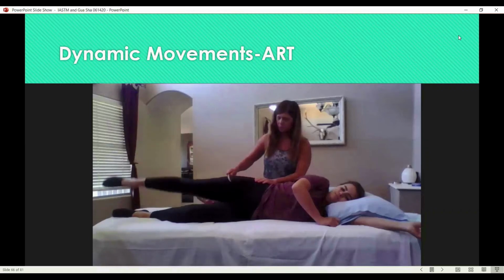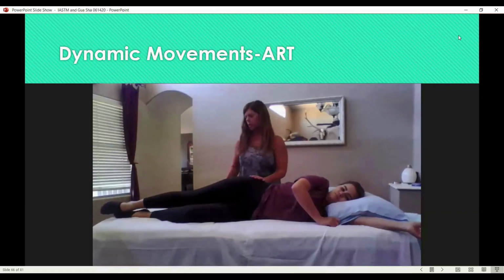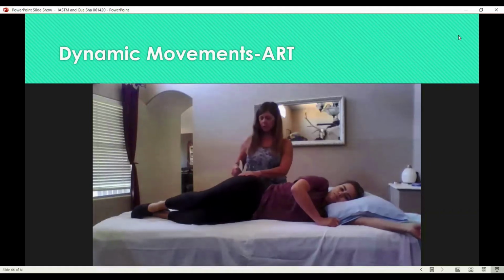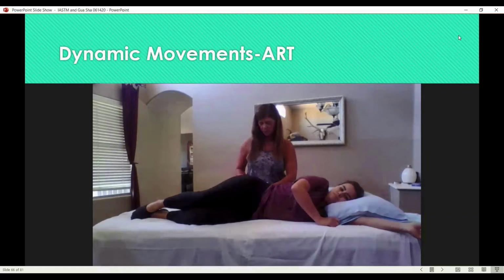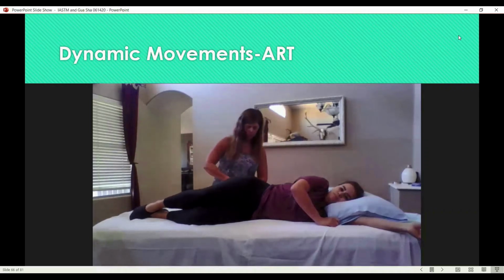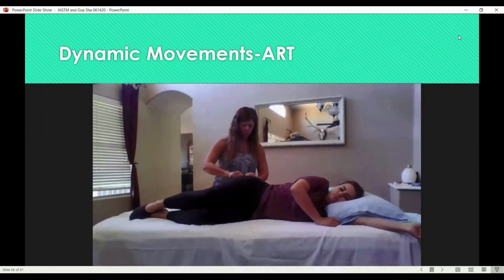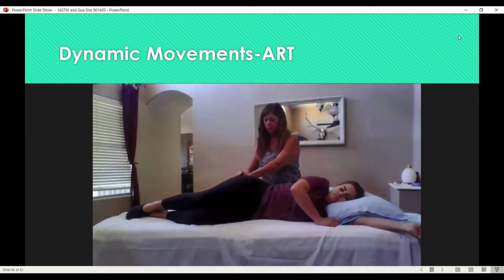Can come down, work on the vastus lateralis, TFL, can work in the abductors, the piriformis. I like the sideline position. Here I'm having her do the clamshell, and I don't know, maybe I should have shown from the other way, but we kind of both go down at the same time. She's going a little bit fast and we're going over the clothes, but you just do this, right? Skin on skin if you can.